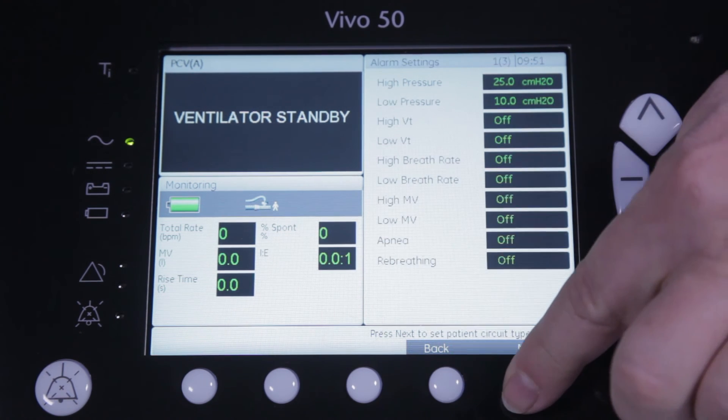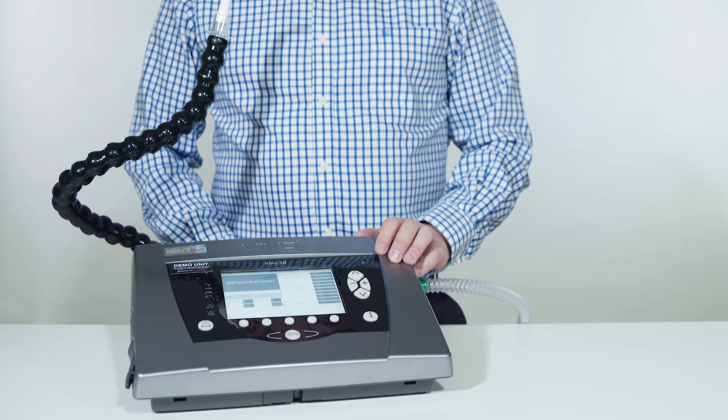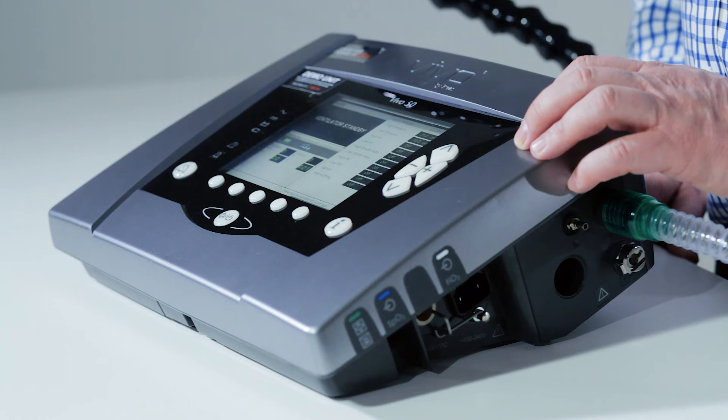When you press next, you will automatically be guided to the alarm menu, where you can select which alarms you want to use to make sure your patient is treated in a safe and efficient way.